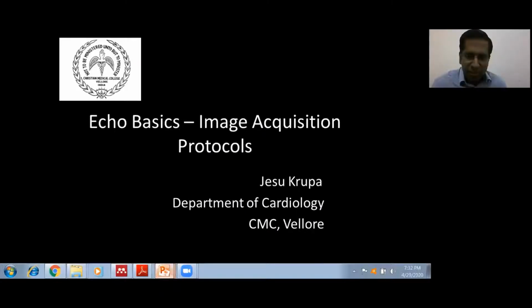So the topic for today is image acquisition protocols in transthoracic echocardiography. And this talk, I've kept it very simple. The idea is to reach out to those who are starting echocardiography or who are very new in the field. This is not for experts. This is not for people who are well versed with the protocols and well versed with advanced imaging, etc. This is a basic talk, and I hope there will be something to take back from this for all of you.